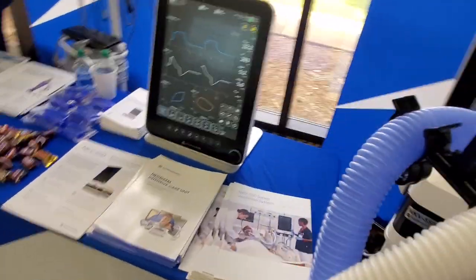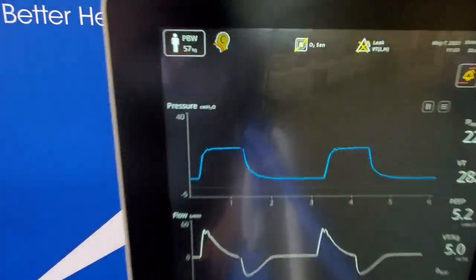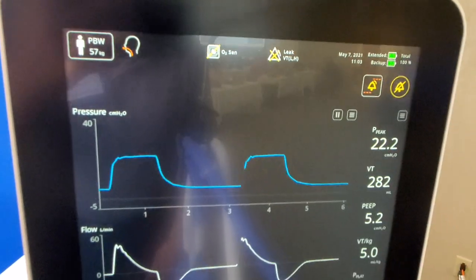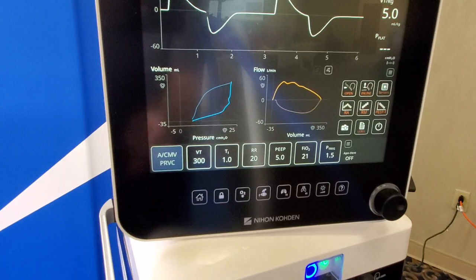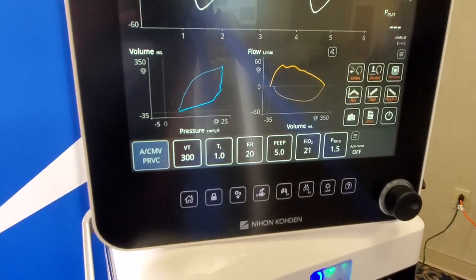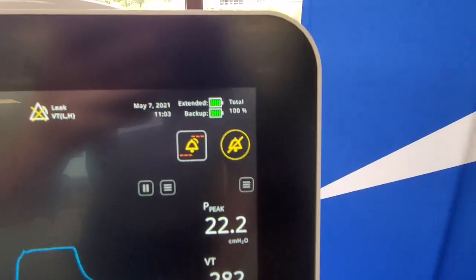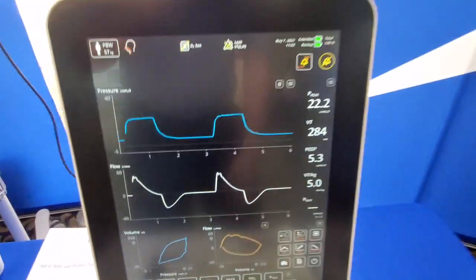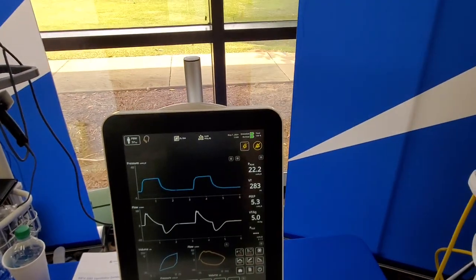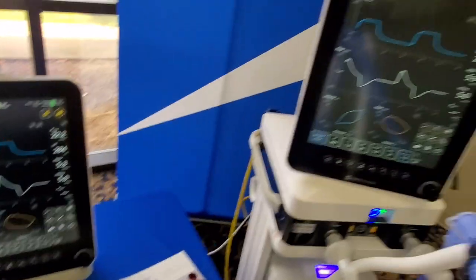Dual tanks on the rear. It's got a beautiful display. My phone might not pick up the detail I'm really talking about, but you do have your smart buttons down at the bottom and the resolution on these waveforms and everything is absolutely fantastic. So that's the NKV-550 by Nihon Koden — never seen one before.